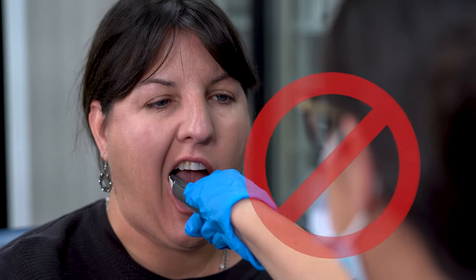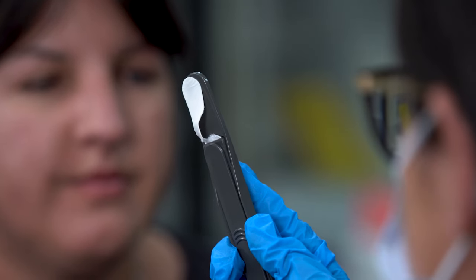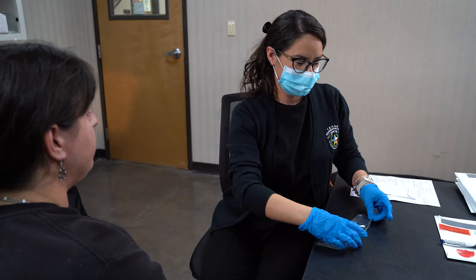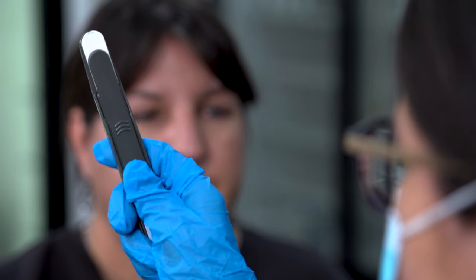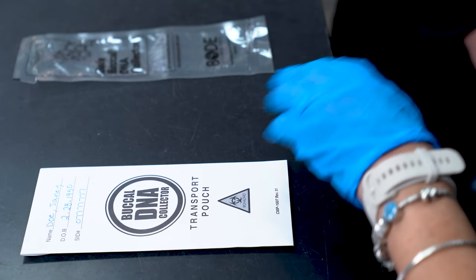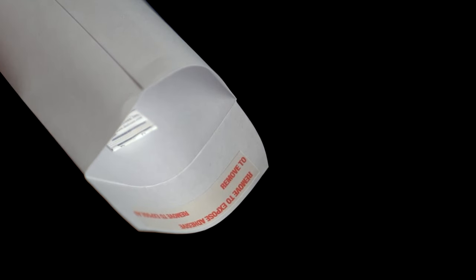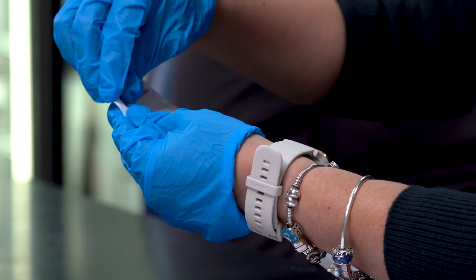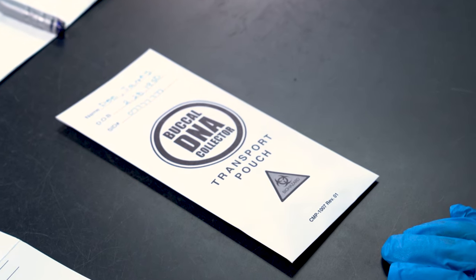Only one cheek is required for collection. Do not use the collector to collect the second cheek. Do not rub the collector back and forth along the cheek, as doing so may damage the collection paper or cause it to dislodge from the collector. If the collection paper becomes dislodged, dispose of it and open another kit. After the eighth swipe, carefully push the slider on the collector forward to protect the collection paper surface. Immediately place the entire collector into the transport pouch. A desiccant is supplied with the transport pouch — do not remove or discard it, as it is needed to dry any excess moisture and prevent damage from moisture buildup. Remove the adhesive strip to seal the envelope. If the pouch is not sealed, the sample will be rejected and you will be notified to collect another sample.